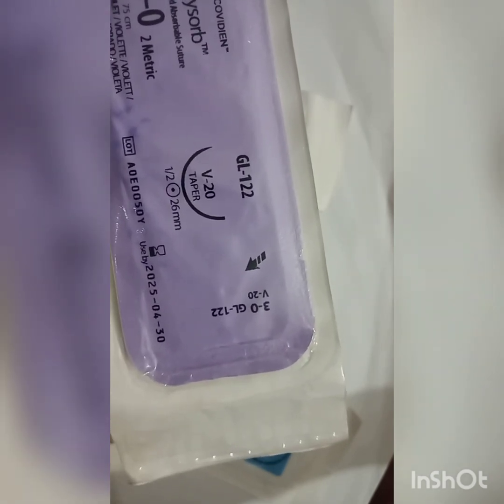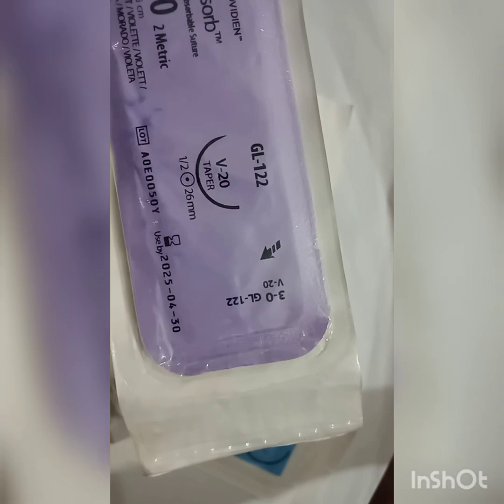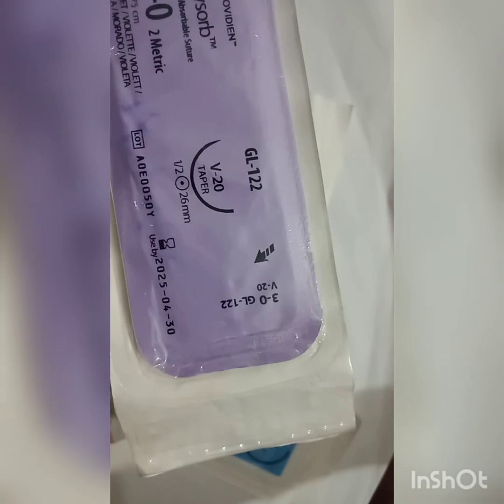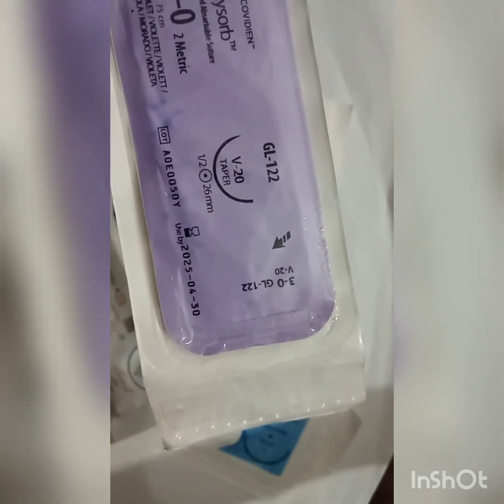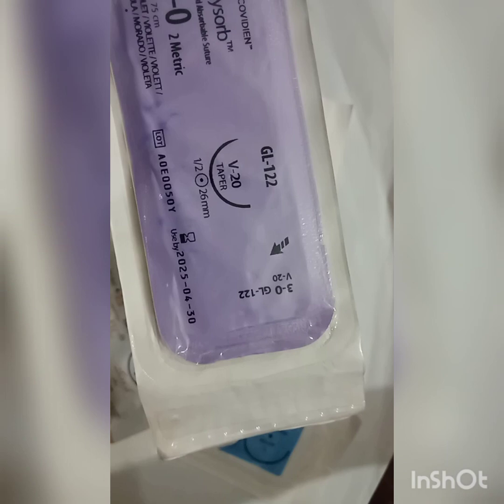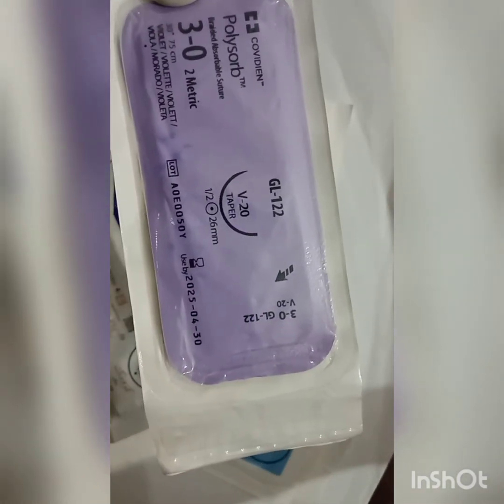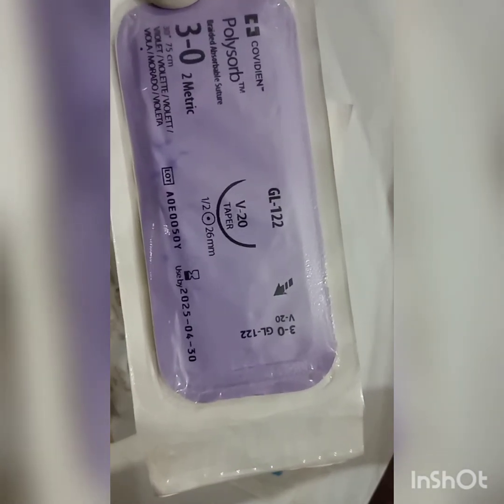But later on, with the manufacturing of smaller diameter sutures, they just reversed the number for the smaller ones, like 2-0, 3-0, so 0 in the last and the number in the beginning. So increasing number, decreasing diameter. The other system is the metric system. The metric system is taken in tenths of a millimeter, and that is different for collagen and different for the other synthetic sutures.